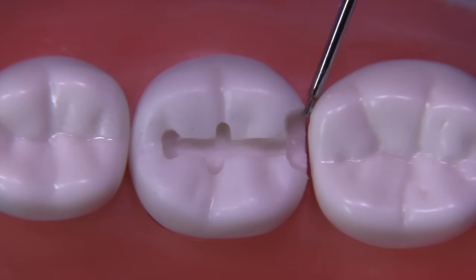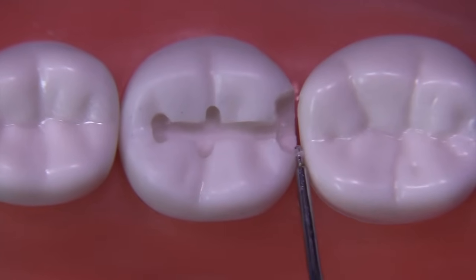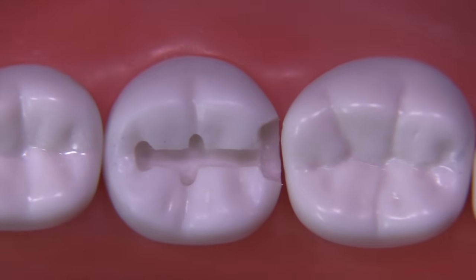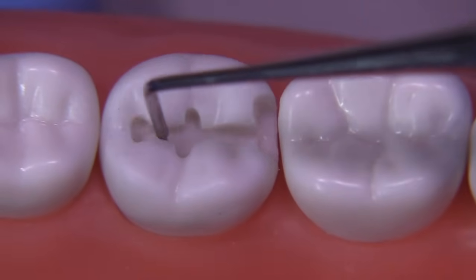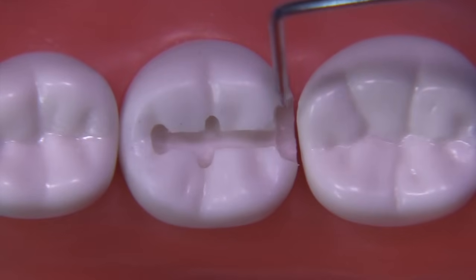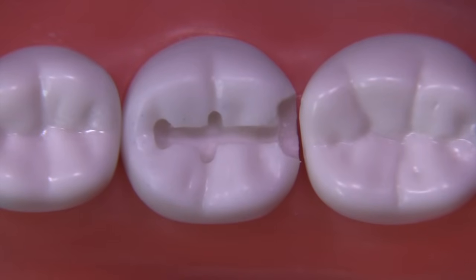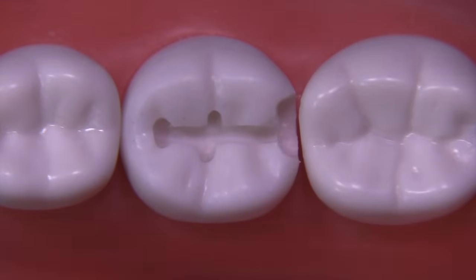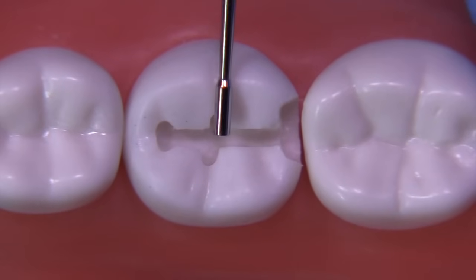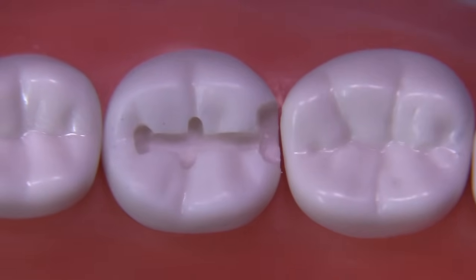The RGS 1 is 0.4 millimeters in diameter. A class 2 should be anywhere from about 0.3 to 0.5, so if the instrument just almost fits or fits just slightly, you're right on the money. The instrument can also be used for depth — this is the pulpal depth — and it measures 1.5 millimeters in length, so it's quite versatile for class 2, class 1, or even class 3 evaluations. Here's the RGS 3, which is one millimeter, and we're measuring the depth of the axial — or the gingival width — and it's a little more than one millimeter.